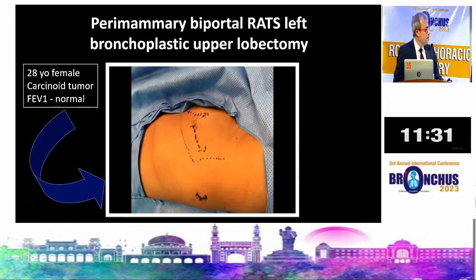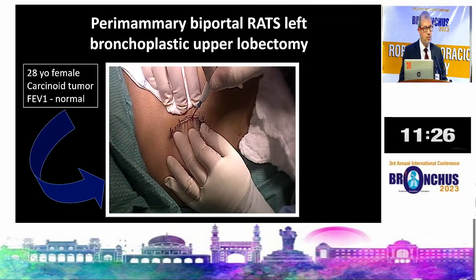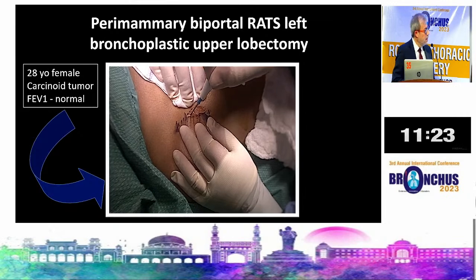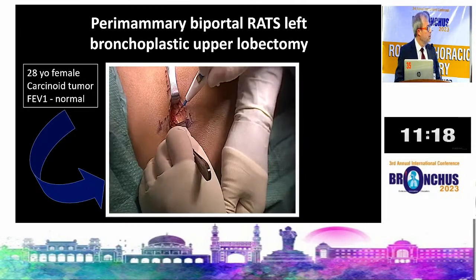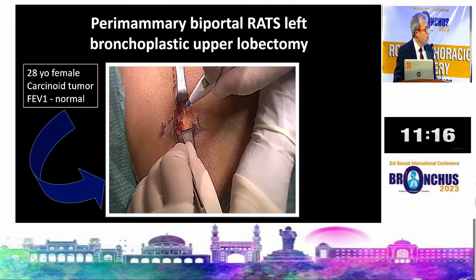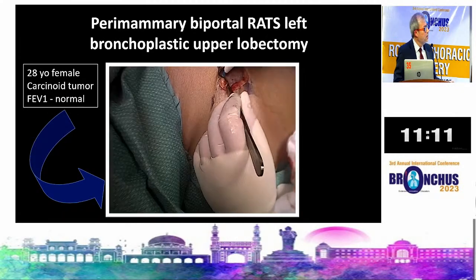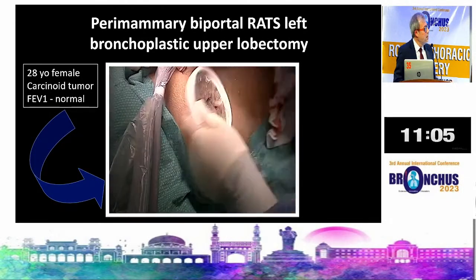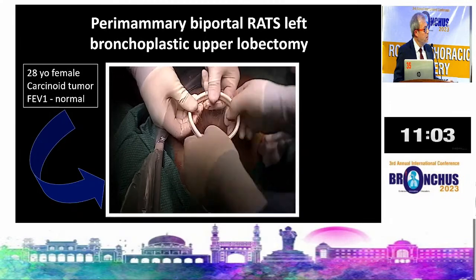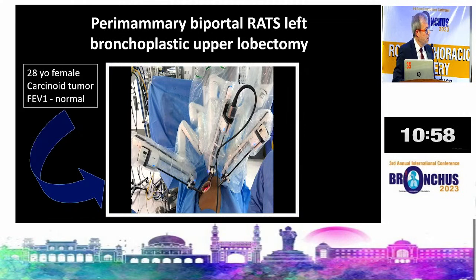Okay, this is the endobronchial lesion. This is the skin marking of the approach. I would like to show you how we do the primary approach. The patient's incision was a little bit more than 4.2 or 4.3 centimeters. We divide the cutaneous tissue up to the serratus muscle. Then we flip up the tissue. As you can see, we open the intercostal space, place the wound retractor, and then you have the approach ready.